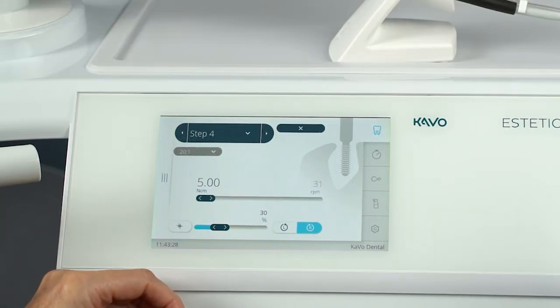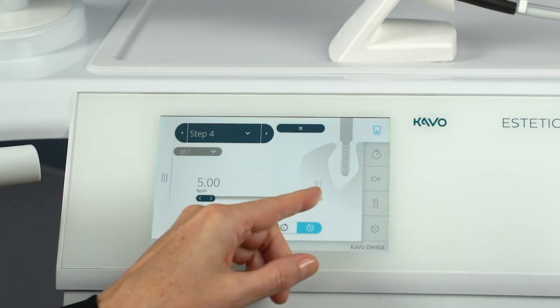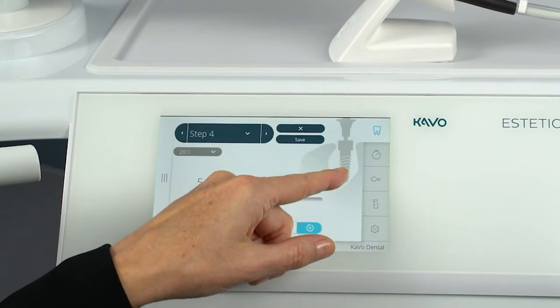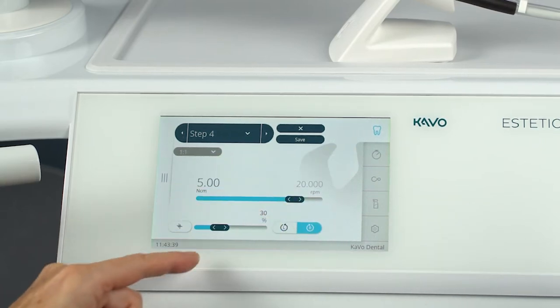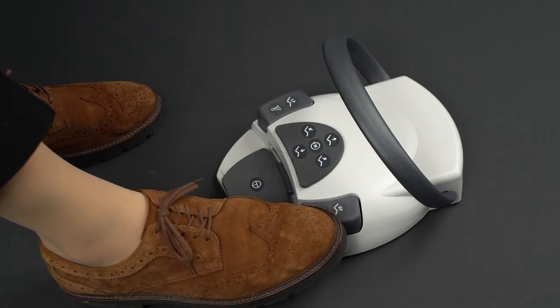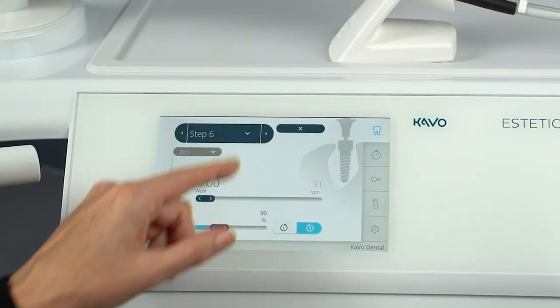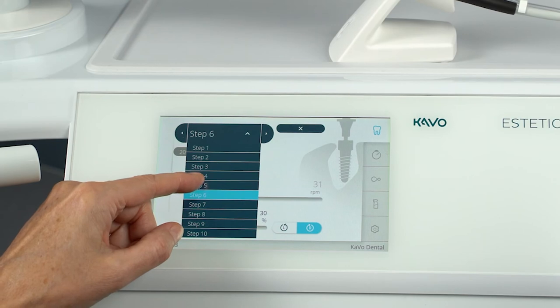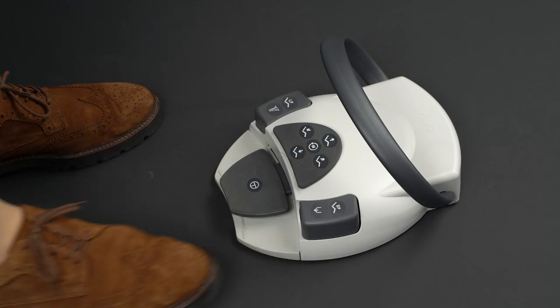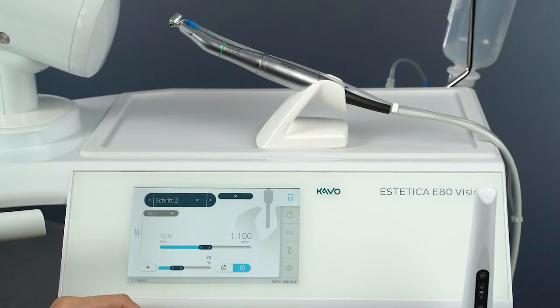You can only customize the parameters within a range that makes sense for the activity. All available values can be set in the free activity. To get to the next step, tap Next Step or briefly press the chip air button on the foot control. If you want to go back one step, tap Previous Step or press and hold the chip air button on the foot control. To adjust parameters in the program step, select the parameter and change it according to your needs.